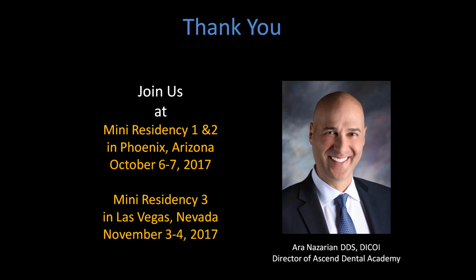I believe in the teachings of Dr. Carl Misch, and he routinely would talk about biomechanics. And if we can place more implants into an area, especially with the Oko Biomedical implant being under $200, and there's several implant systems out there under $200, what's it going to cost us to place 1 or 2 more implants? Is that worth the investment and the insurance to maintain the longevity of the prosthesis?